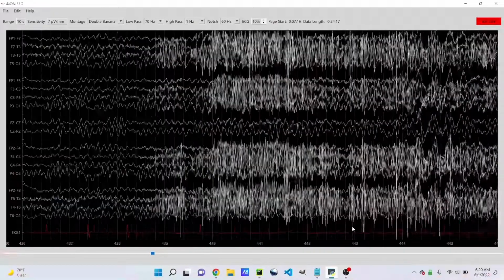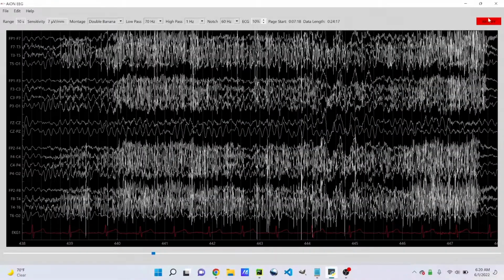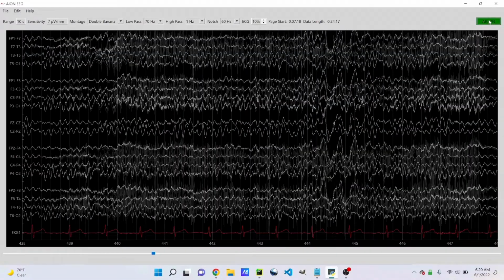You need good hardware, because this memory is the hardware that allows the software to run in the first place. And now that these machines are getting better and better, new opportunities are available, such as this artifact reduction to remove noise on the EEG: remove muscle contamination, eye blinks, movement, and general artifacts that pop up on the EEG, so you just have the clear brainwaves for the doctor to see and make the best reading of the EEG and diagnosis so they can best treat the patient.